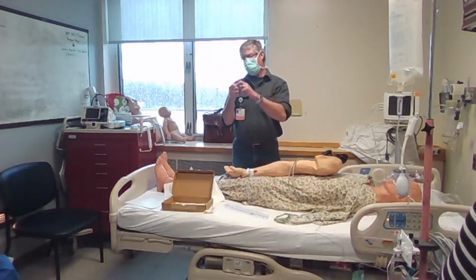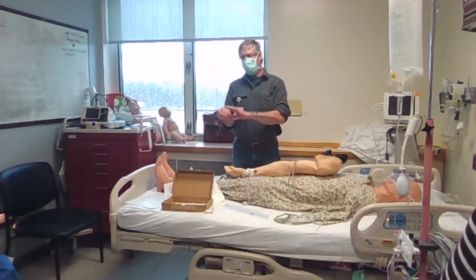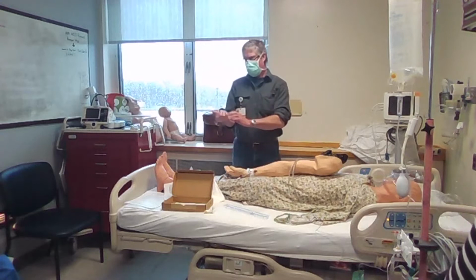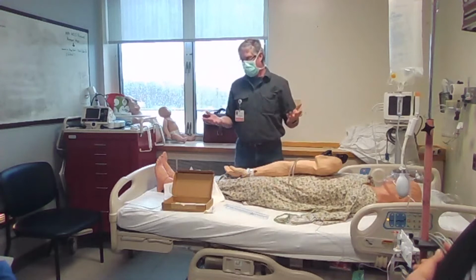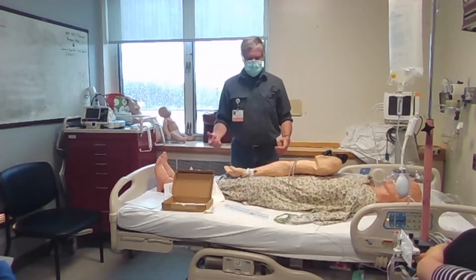So it doesn't develop a blood clot in the end of it, or the patient's wrist starts to move and it starts to constrain the blood flow into it. So those are really the big things to think about, like why is it not working? Easy things to think about.